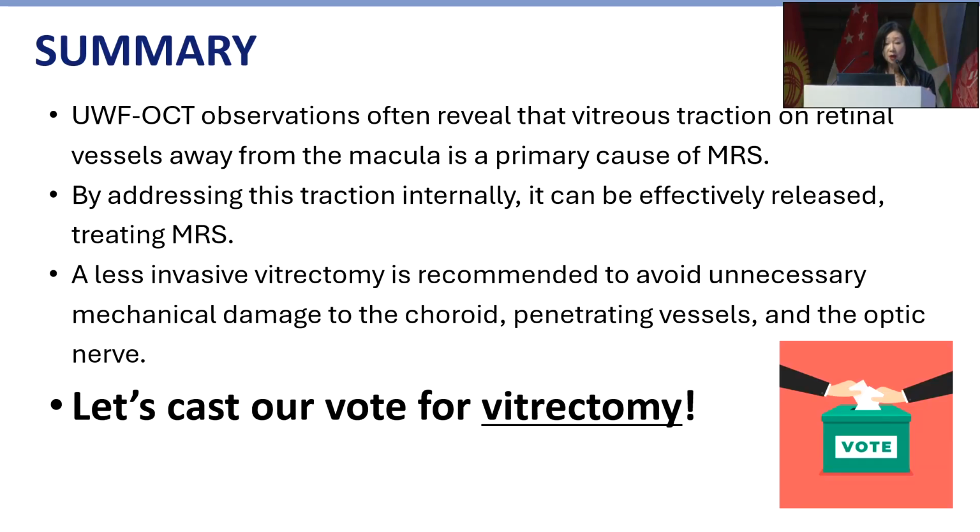To sum up, wide-field OCT often reveals that vitreous traction on retinal vessels away from the macula is a primary cause of retinoschisis. By addressing the traction internally, it can be effectively released, treating retinoschisis. A less invasive vitrectomy is recommended to avoid unnecessary mechanical damage to the choroidal penetrating vessels and the optic nerve. So, yes for vitrectomy.